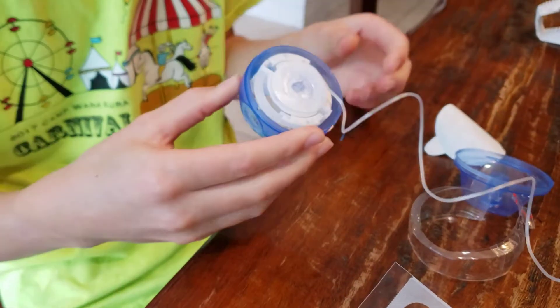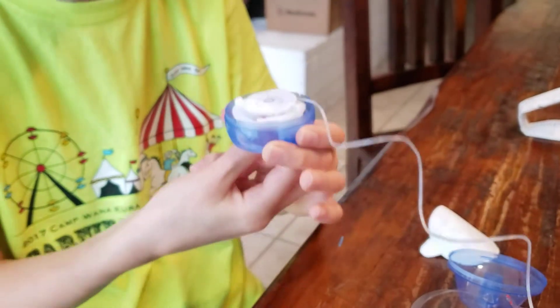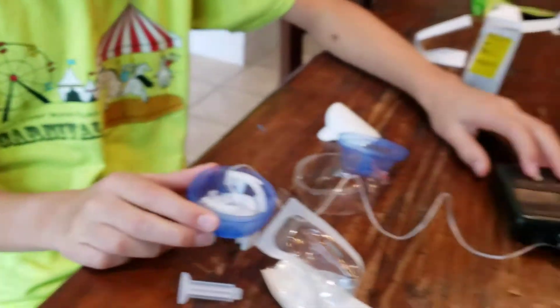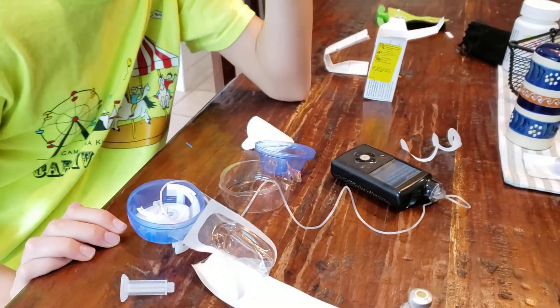You don't want to put your fingers here because you don't want it to inject. So you cock it until there's that little snap and that clip. We're going to pause real quick so we can get Aiden ready, and he's going to show us how we do it.